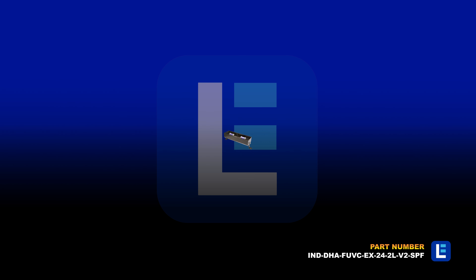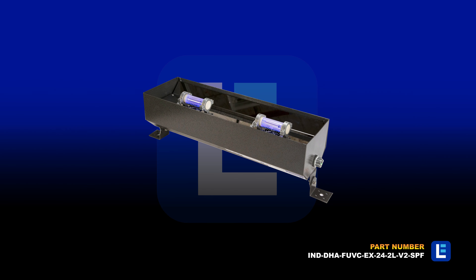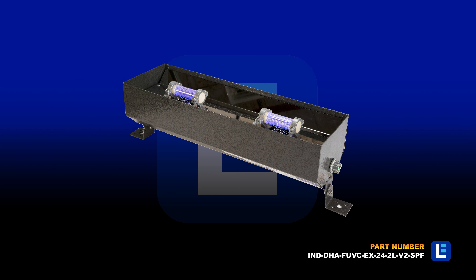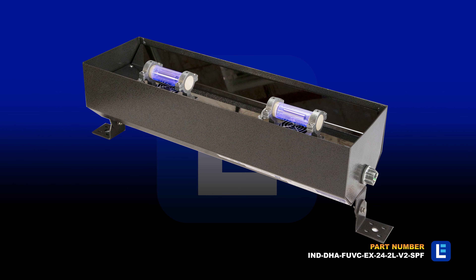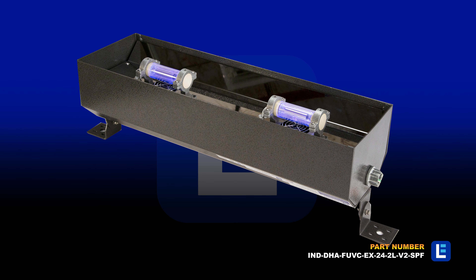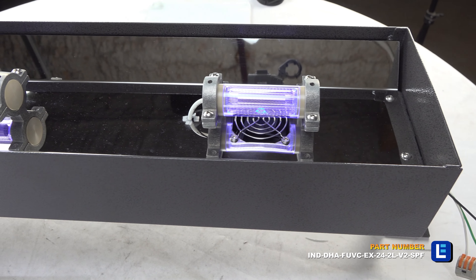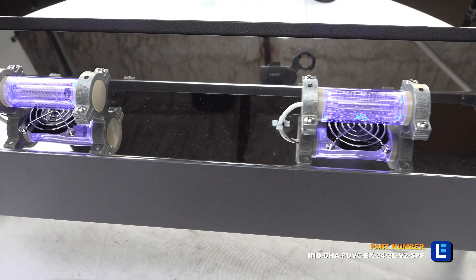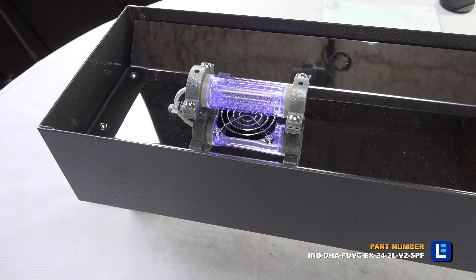The Larson Electronics IND-DHA-FUVC-EX-24-2L-V2-SPF Far-UV Sanitation Fixture disinfects 99% of viruses, bacteria, mold, and spores in locations requiring an aesthetically pleasing germicidal fixture for occupied areas. This eye and skin-safe disinfection unit uses two 40-watt excimer lamps that emit Far-UV 222 nanometer germicidal light.